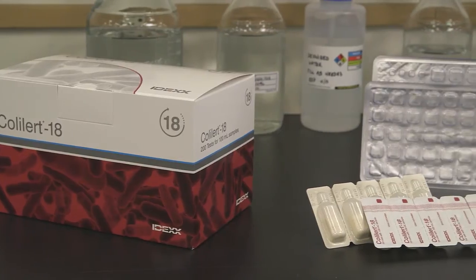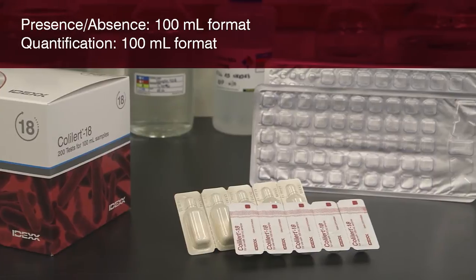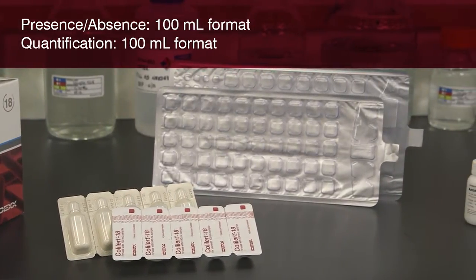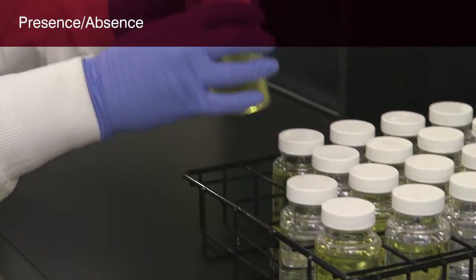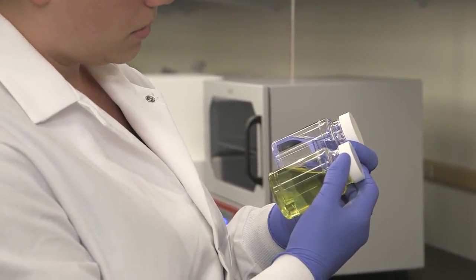ColAlert 18 is available in a 100 milliliter format. In the next few minutes, you'll learn how to use the ColAlert 18 test for presence-absence detection and for quantification using the QuantiTray system. In the first demonstration, you'll learn how to use the ColAlert 18 test for presence-absence detection of total coliforms and E. coli.